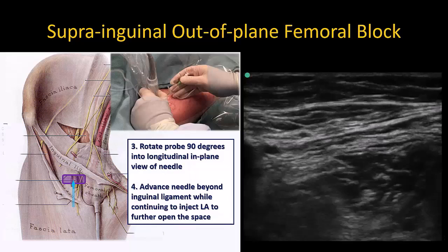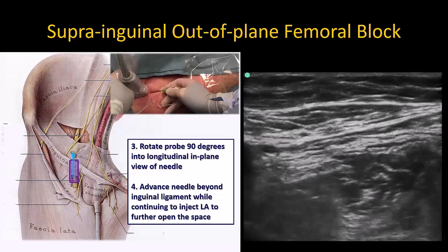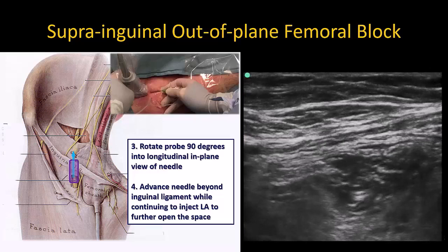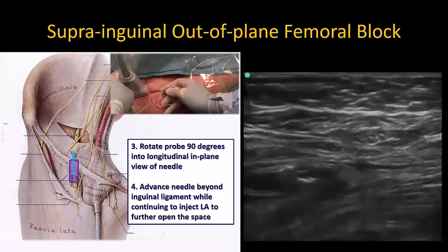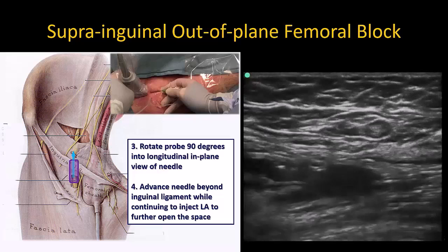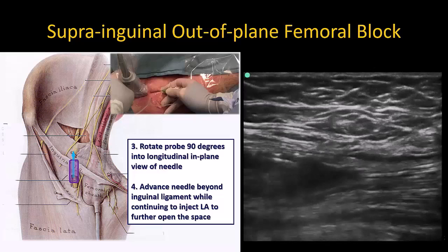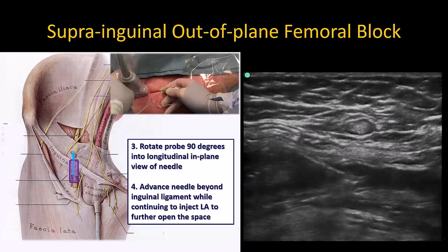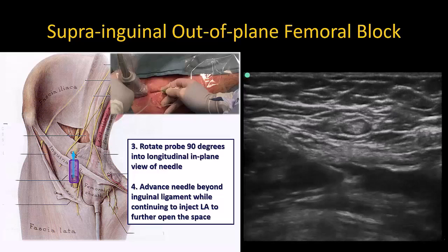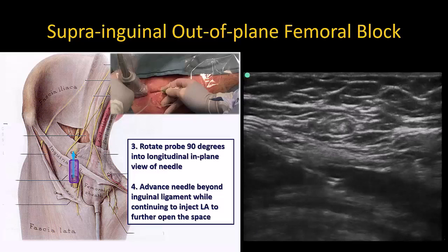I inject approximately 10 milliliters to open up the fascial compartment adequately. At this point, the probe is rotated 90 degrees to obtain a longitudinal view of the needle and its tip within the subfascial lake of local anesthetic. The iliopsoas muscle is visible deep to the hypoechoic fluid. The needle tip can now be advanced further cephalad into a suprainguinal location proximal to the inguinal ligament, continuing to inject local anesthetic to open up the space and observe that it is spreading in a cranial direction over the muscle and into the pelvis.